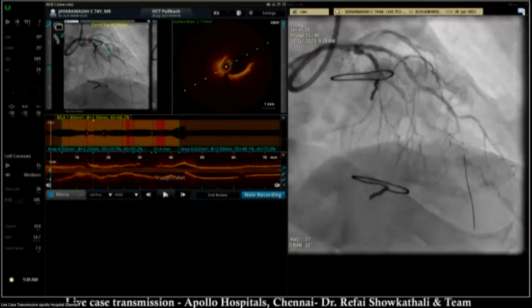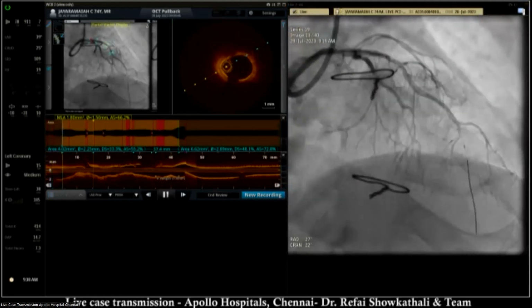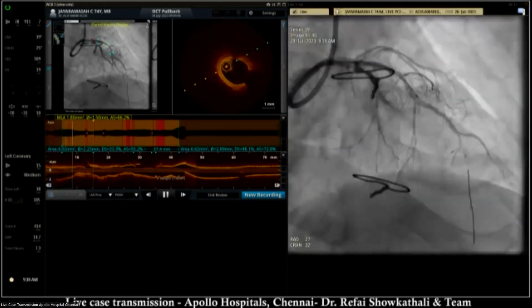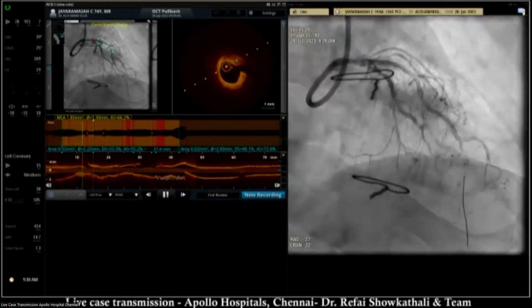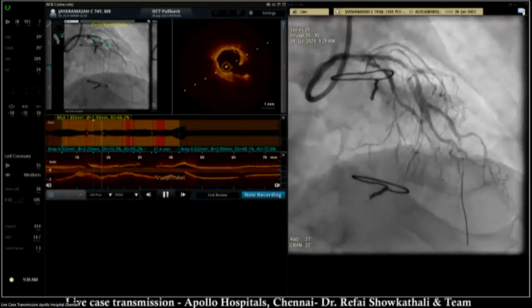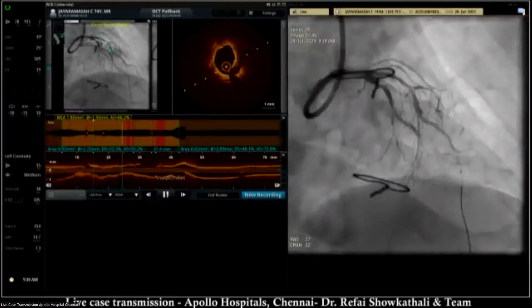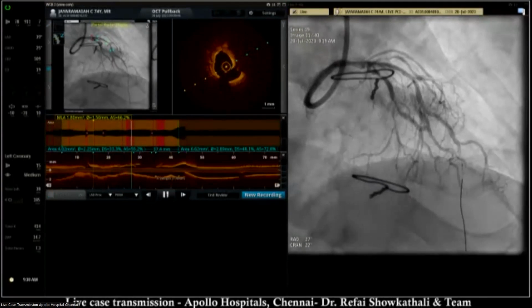I did. Shall we show the next OCT after, and you'll see the cracks and ruptured plaques with the normal NC balloons, which is running on the screen now as we speak. So would you agree that there are some decent cracks and disruption and dissections of the plaque? Yeah, we agree with that, Refai. I wanted to ask for any questions from the audience. Please use the mics and come and ask us.